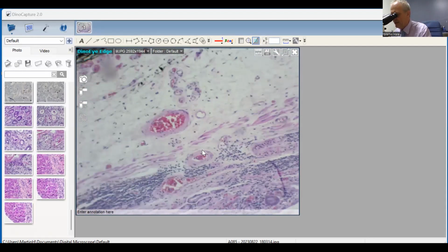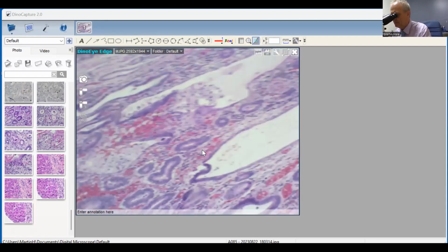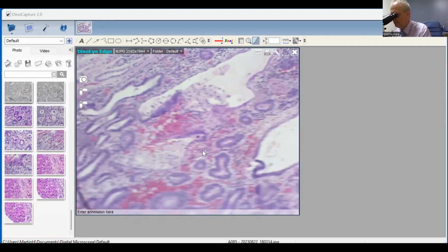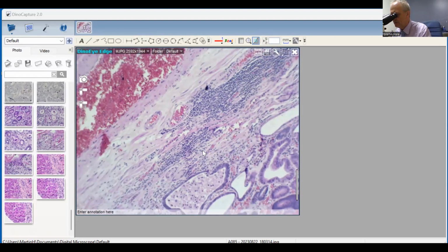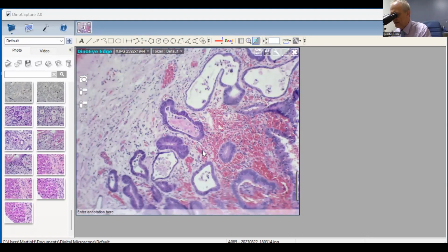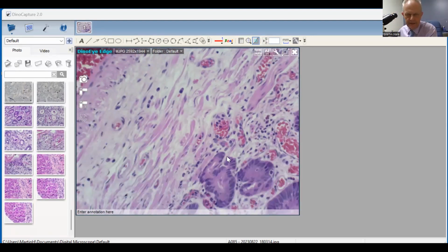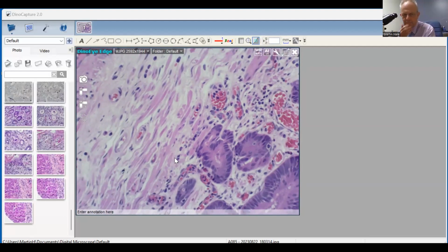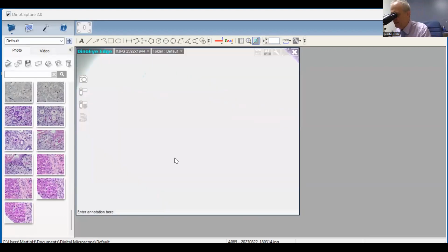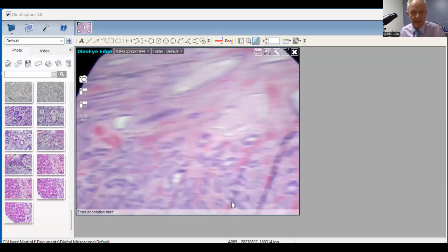And if you look here, so that's a good area there. So there you can see tumor there, and there's the muscularis. Okay, so this is a T1A lesion and was resected. Okay, Vikash, over to you for the last case.